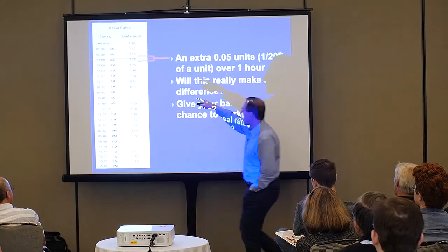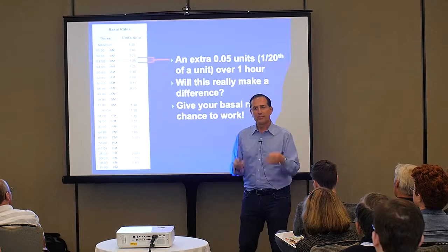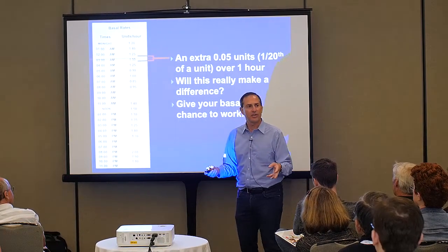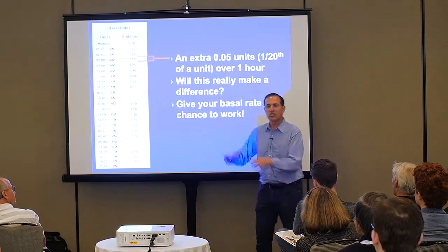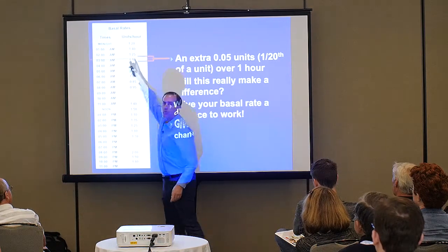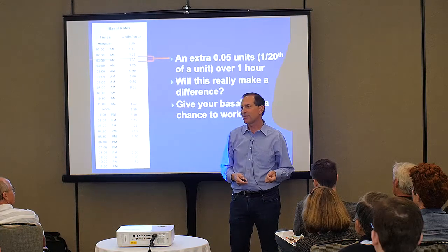So I did not make any change here. I knew that most of these rates were unnecessary, but she liked to change things. She was doing great. So who the heck was I to change anything just because science says it doesn't help? For her, it was working great. But in general, that's totally overkill. I mean, really, this extra 1/20th of a unit going in over an hour, is that really going to make a difference? Really?